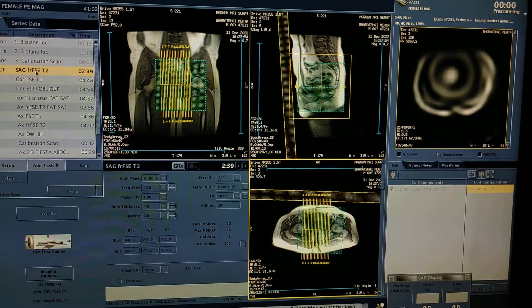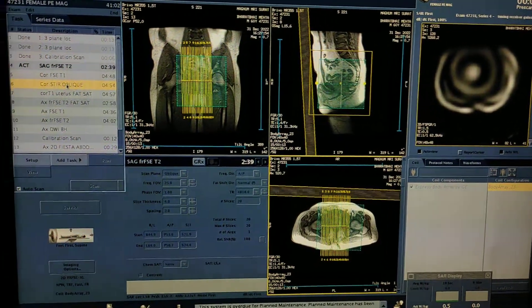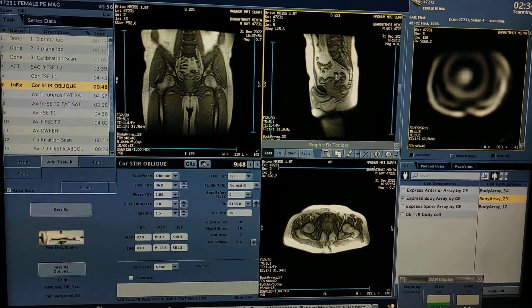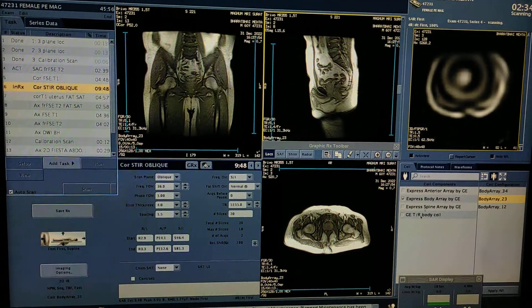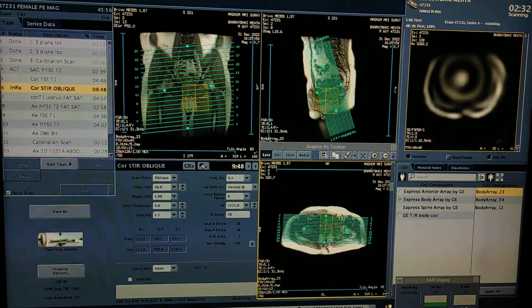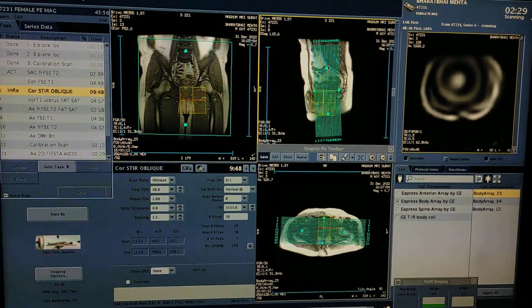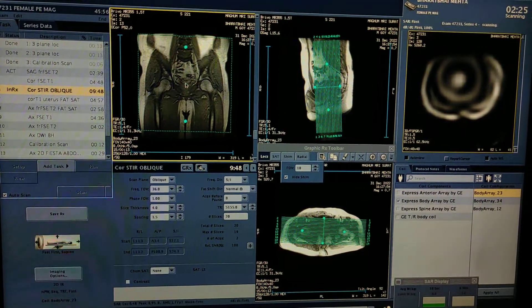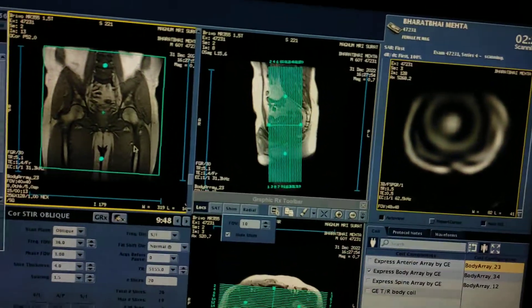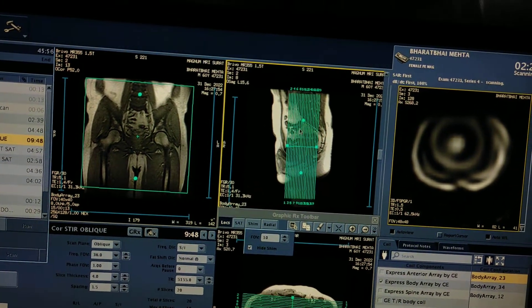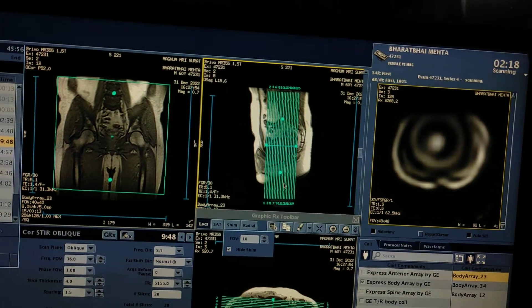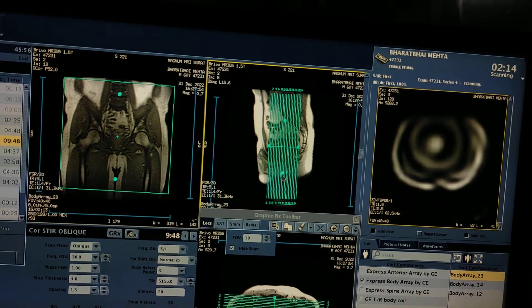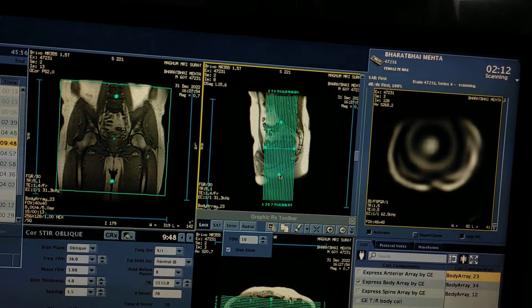After sagittal, I will plan coronal STIR. Simply double click to open coronal. If you want coronal, you have to plan on sagittal and axial, so I will click on axial. The coronal sequence has to be planned oblique — this is the true coronal plane, vertical. After getting the sag I will show you the angulation for prostate.